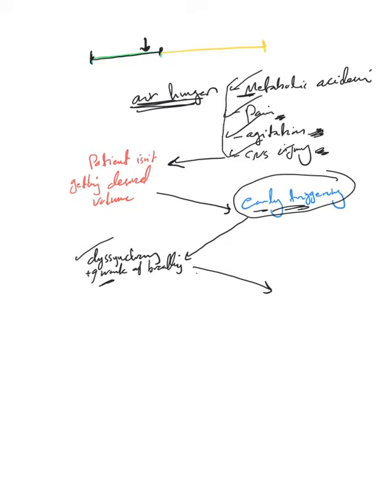On the other hand, what you could do, if you are doing VC, volume control mode, simply you can decrease inspiratory time by increasing flow rate. That way you will deliver the volume the patient needs faster, and this will allow proper triggering rather than early triggering and all this desynchronization.